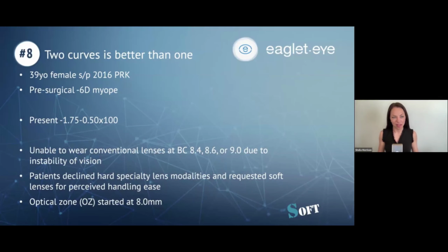Now, in sticking with my theme of post-refractive eyes, I'm going to switch gears again and move into custom soft. Soft lenses historically have been a little bit more forgiving than rigid lenses when fitting. That being said, contact lens discomfort and discomfort-related dropout remain a huge issue in our clinic, not just for post-refractive eyes, but for patients of all kinds. Some of the reasons we see contact lens dropout are ocular surface issues, but also a mismatch of ocular shape to a plastic.